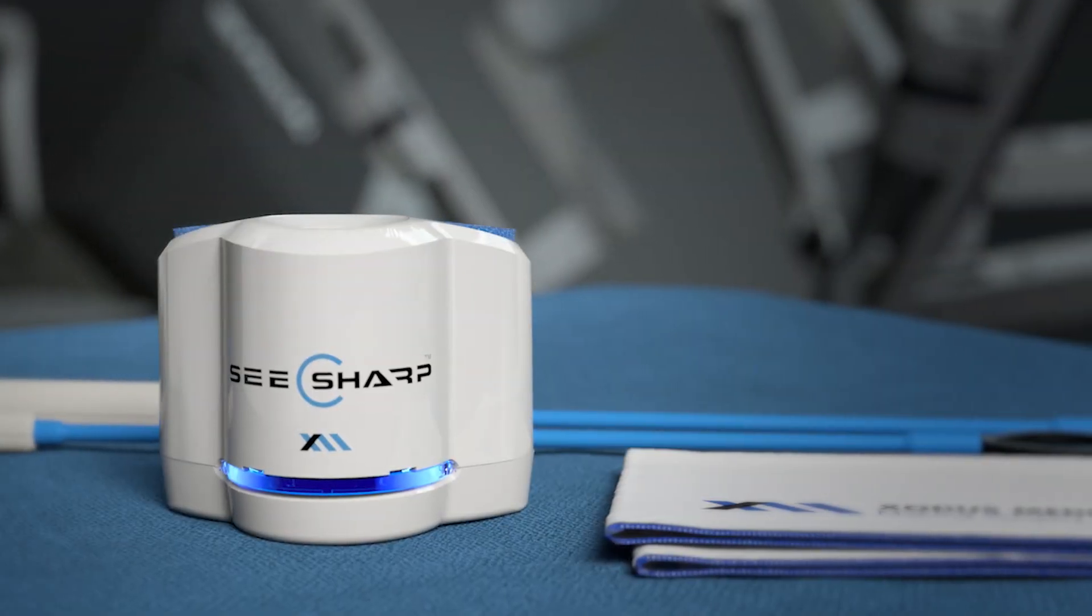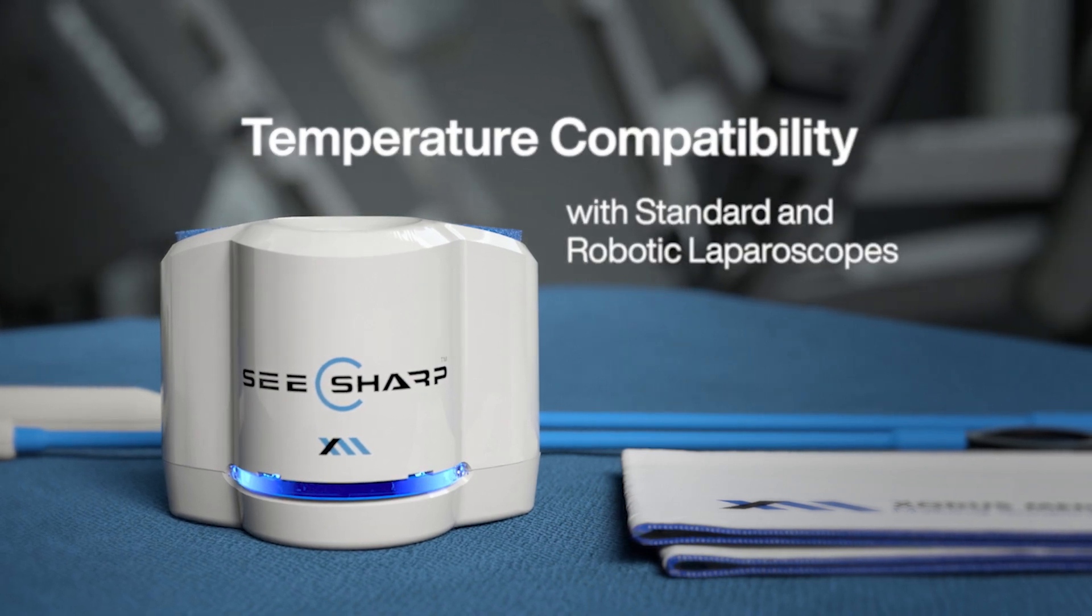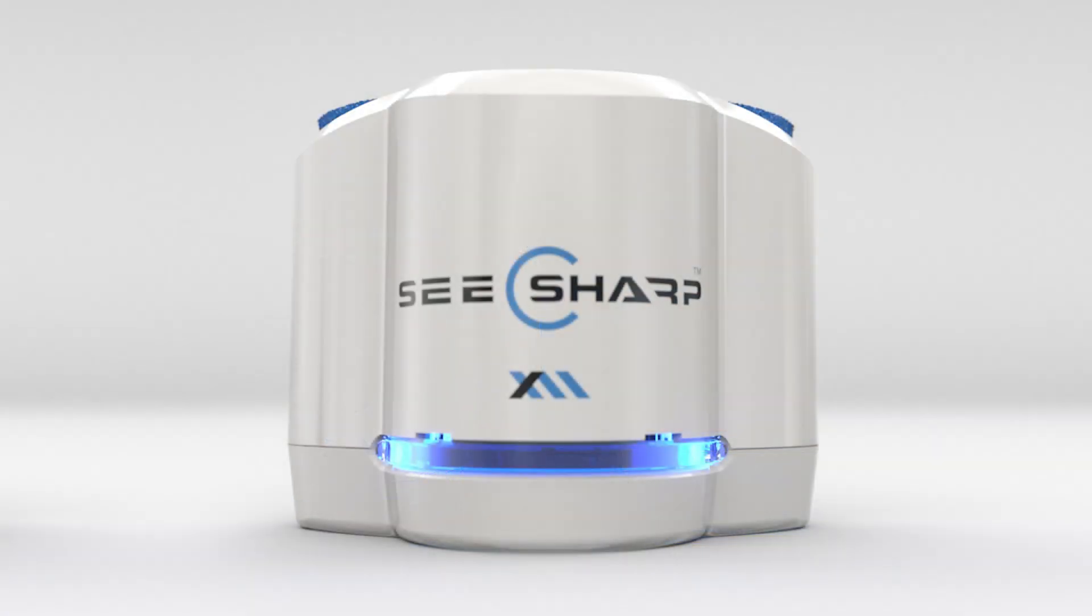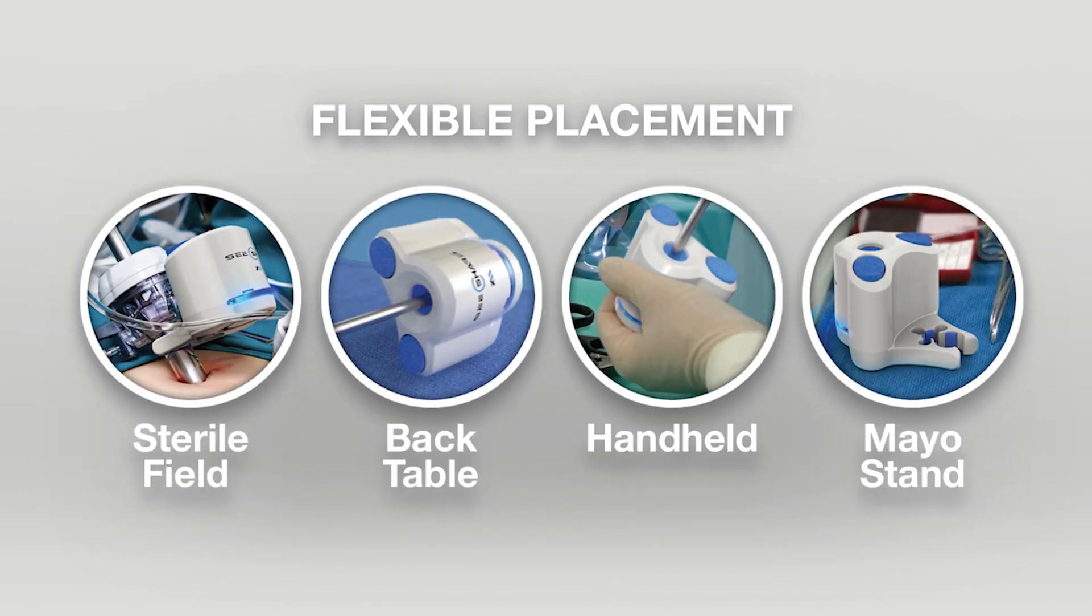The C-Sharp operates within a thermostatically controlled temperature range, safe for both standard and robotic laparoscopes. The C-Sharp is compact and stable, allowing for flexible placement on any sterile field.